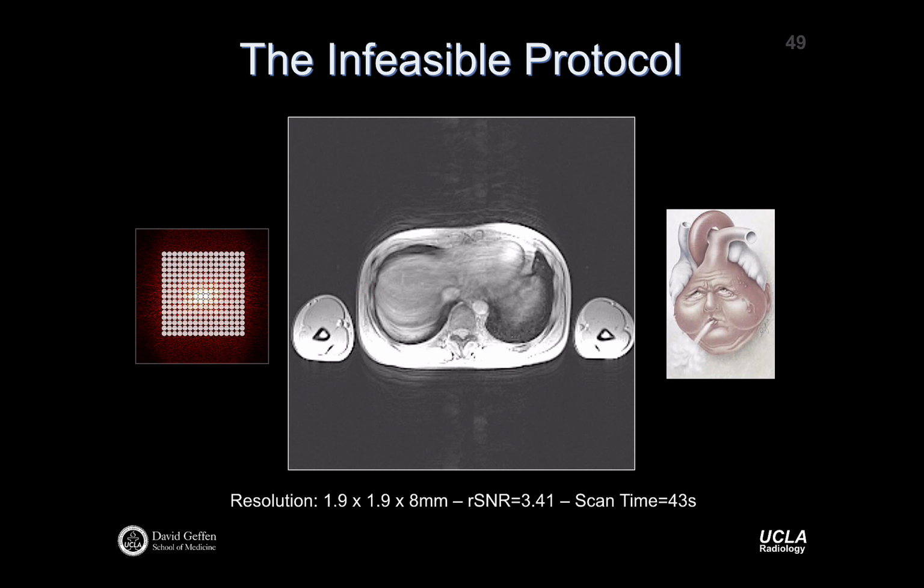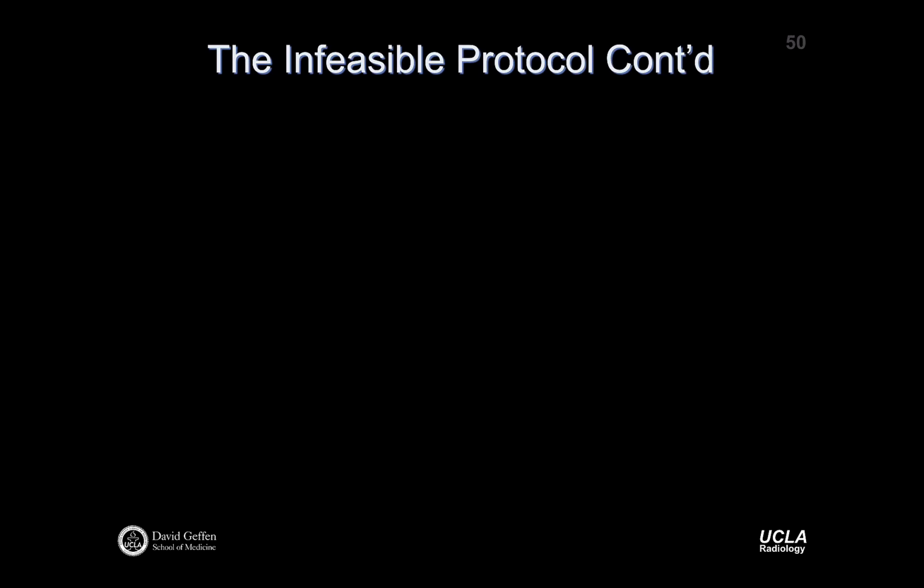You'll see with the k-space data that I'm going to get more of it, I'm going to get less of it, or I'm going to spread it out. It's going to change my field of view, it's going to change my resolution, and it'll have impacts on my image quality. So this is the starting point for this exercise, right? Good? Okay. So let's make some changes, right?